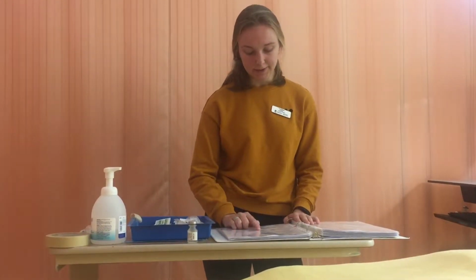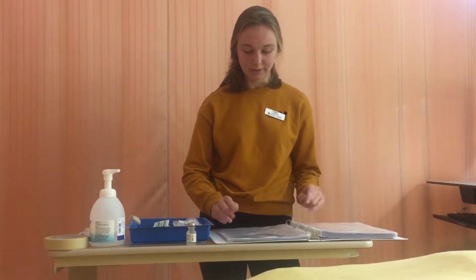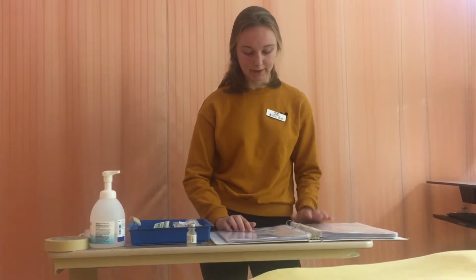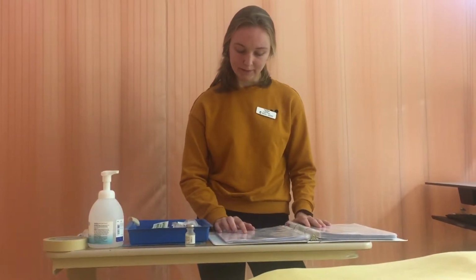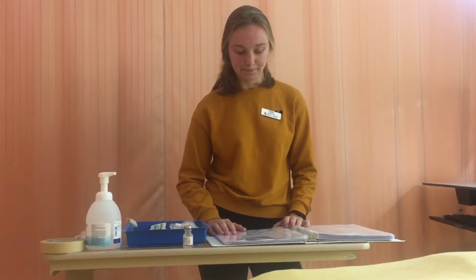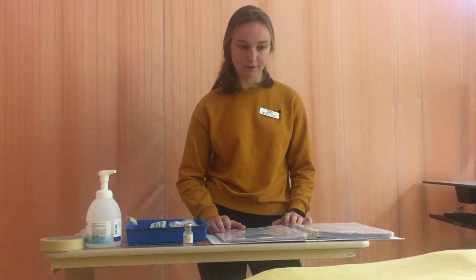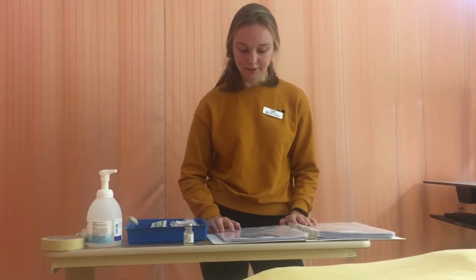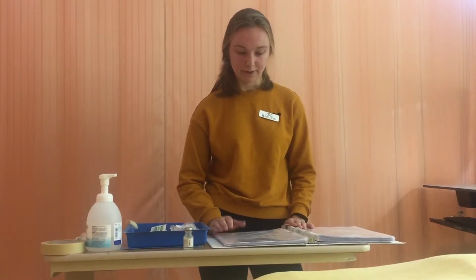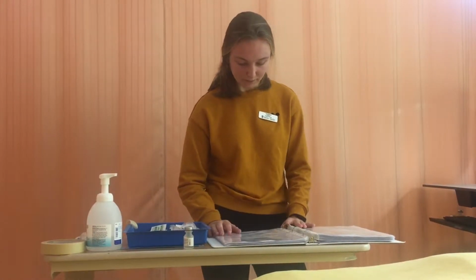We're going to be giving it in normal saline. It can be given in normal saline or dextrose, but she has no need for dextrose. So we're just going to be giving it in normal saline, and it can be administered over 15 to 30 minutes, and we're going to be giving it in 30 minutes just because we don't want her to have any side effects to the medication, so we want to catch it early if she does. So if we give it over a longer period of time, then we'll be able to catch the side effects when they're not as intense.